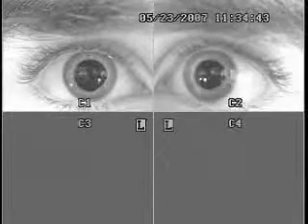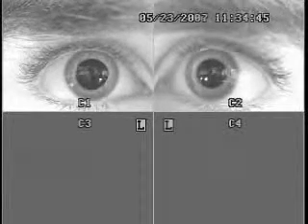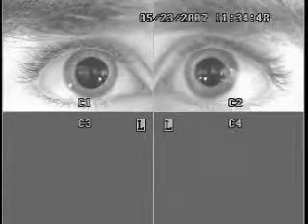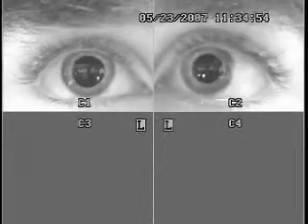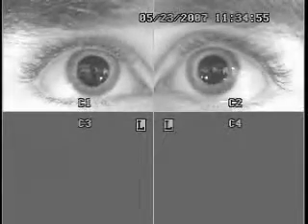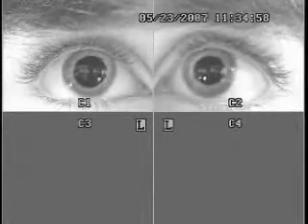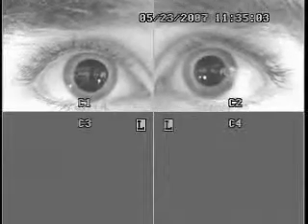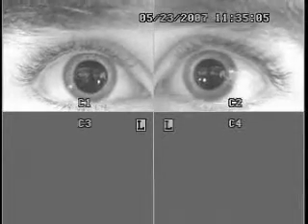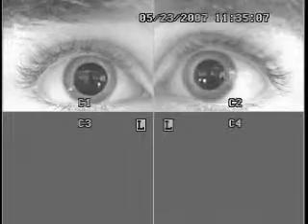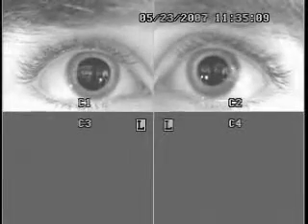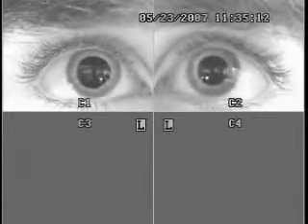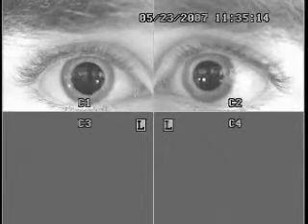In the first of the pre-test assessments, Matt, I noticed that your left pupil is a little bit larger than your right pupil. Has anybody ever told you that before? Have you suffered any head injuries recently that you're aware of? So, no medical conditions that you know of? Nothing with your eyes? When I was younger it was just like that, and that's gone away — that was a long, long time ago. So, we're not going to worry about that slight difference in pupil size, but it is there.